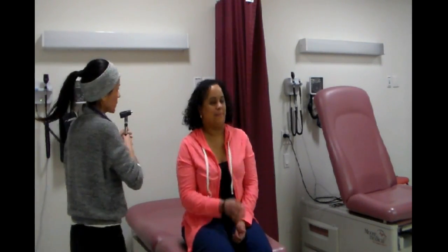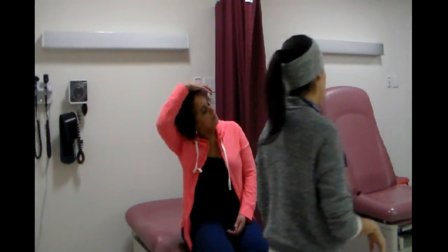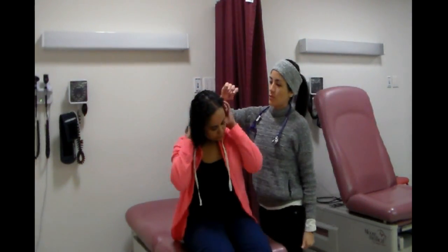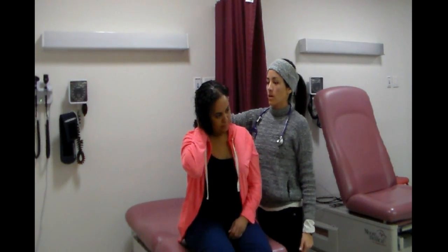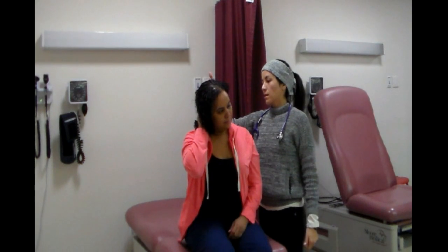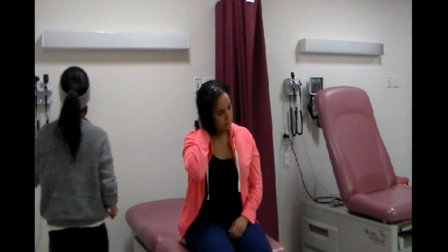Thank you. And then the next thing, on the other side, I'm gonna press on the tragus. Any pain? No pain. The mastoid? No pain. Again, the ear looks fine. There's no redness, no swelling, no discharge anywhere. And then I'm gonna look inside the ear again.